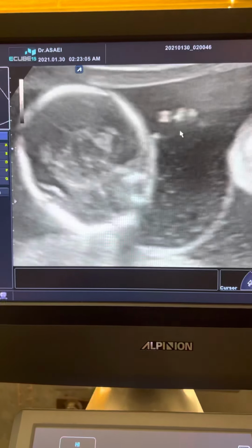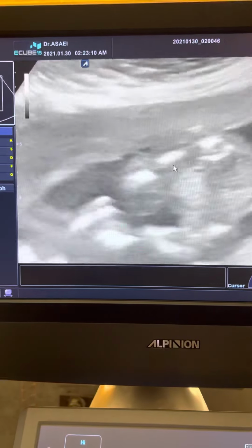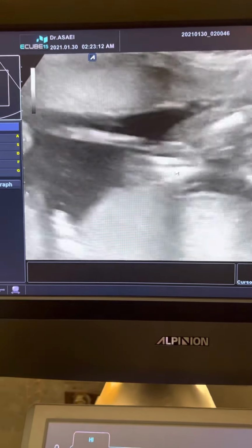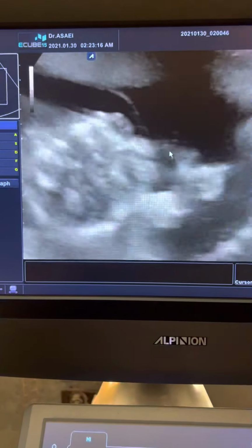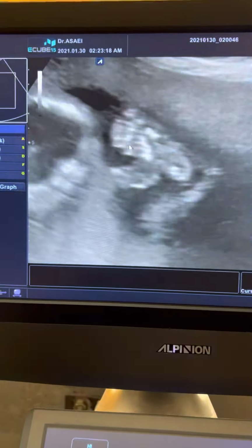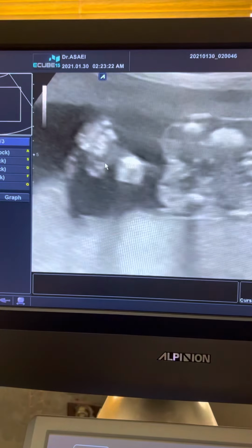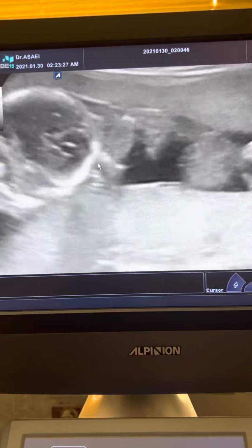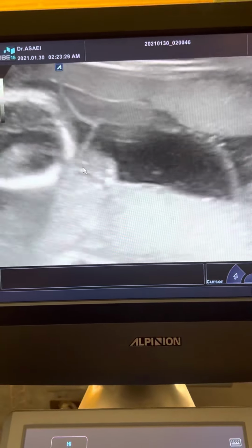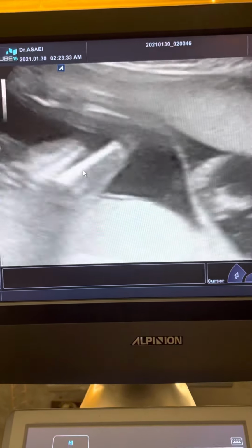Here is the hand of our fetus we are looking for. So 5 hands, 5 of course fingers. So we have the foot of fetus B, 5 fingers. Another foot here, again 5 fingers, the toe and other fingers.